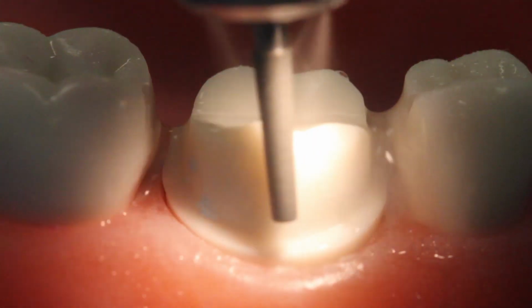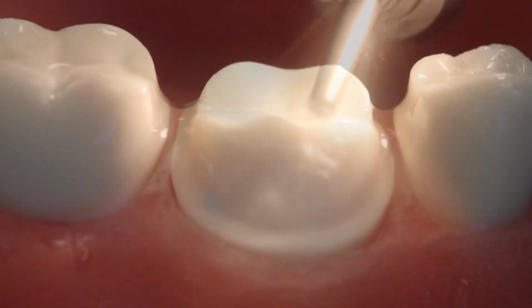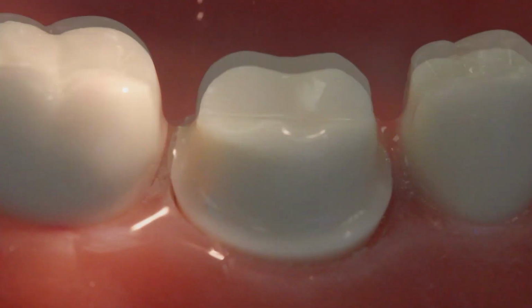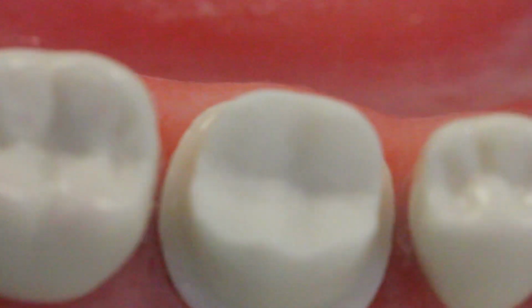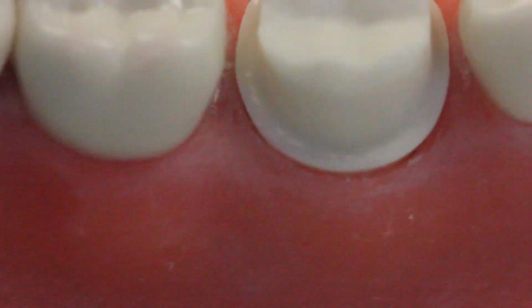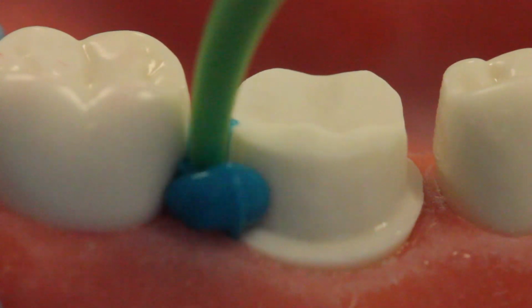The important thing here is to really make sure that your margin, or where the crown will meet the tooth structure, is extremely smooth, as well as not having any sharp points or line angles. So here you can see that we have real smooth margins and a tooth that has been reduced to the proper dimensions.